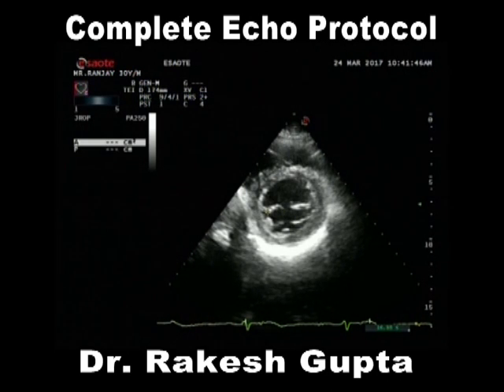And we measure the clear tricuspid valve area and mitral valve area. This mitral valve area I am just planimetering, it should be inside. Whatever the diagnosis is, I am repeating again and again, mitral valve area is the final area, whatever the gradient, whatever the other things are, except for one condition where the mitral stenosis is distal to the mitral valve area, as in subvalvular apparatus.